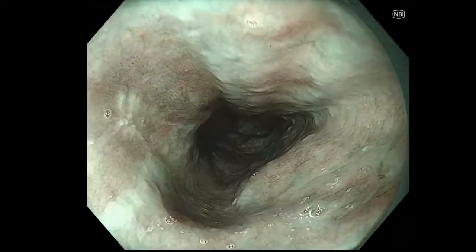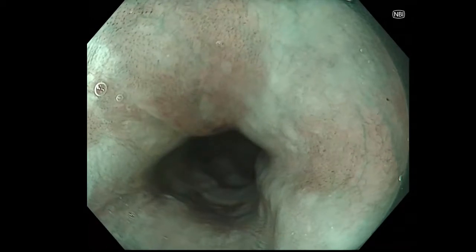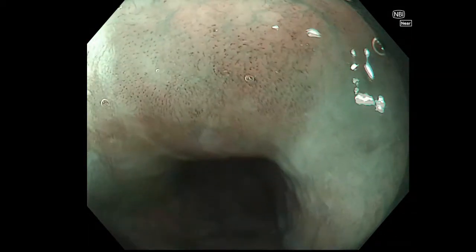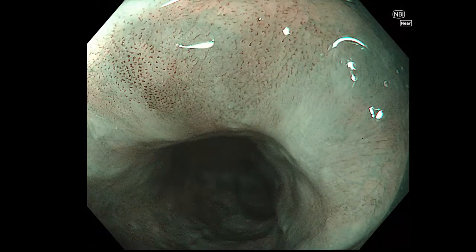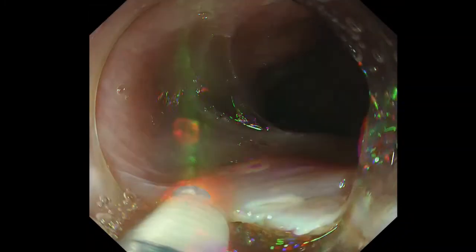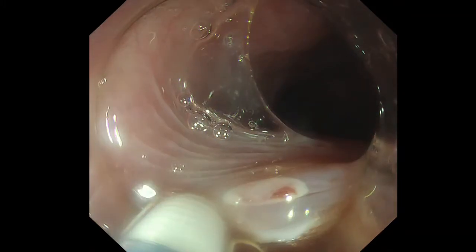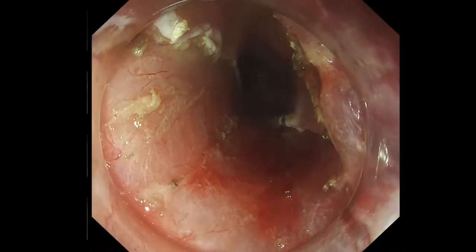This is the esophageal region in case 3, which was histologically diagnosed as a squamous cell carcinoma on biopsy examination. We performed endoscopic submucosal dissection of this region, and the resected specimen was diagnosed as a squamous cell carcinoma with invasion to the lamina propria.